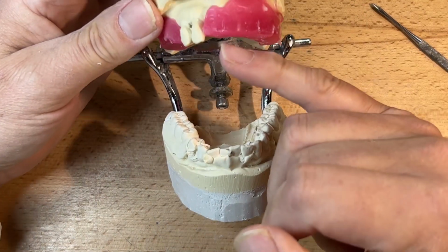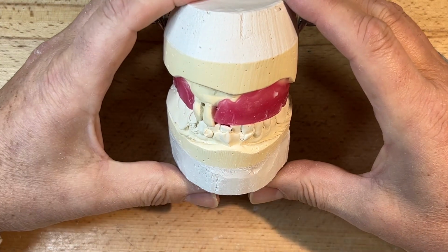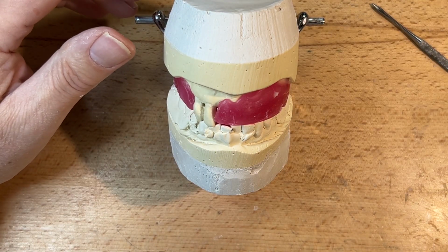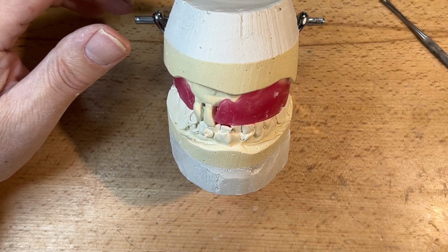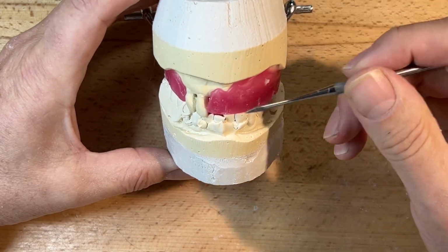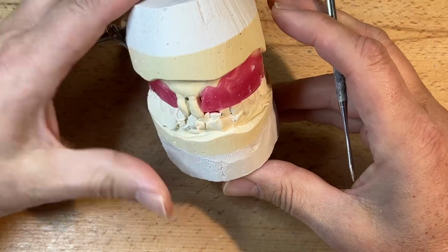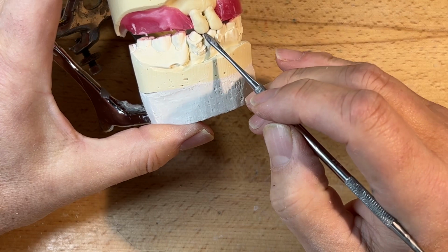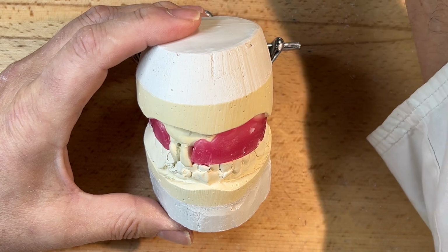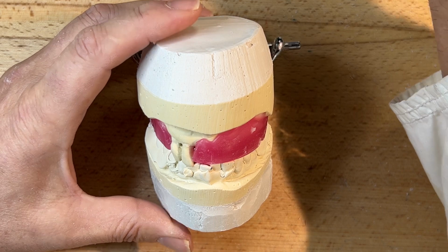The client here will be having 1-2 and 1-3 extracted, and we're going to do a wax tooth try-in prior to extraction and completion of the immediate denture to verify aesthetics and CR registration, the bite registration, vertical dimension. In this case, no bite opening here. And what I'm going to do here live, I'll just attempt the best I can and explain a few things while we're setting up the immediate denture.